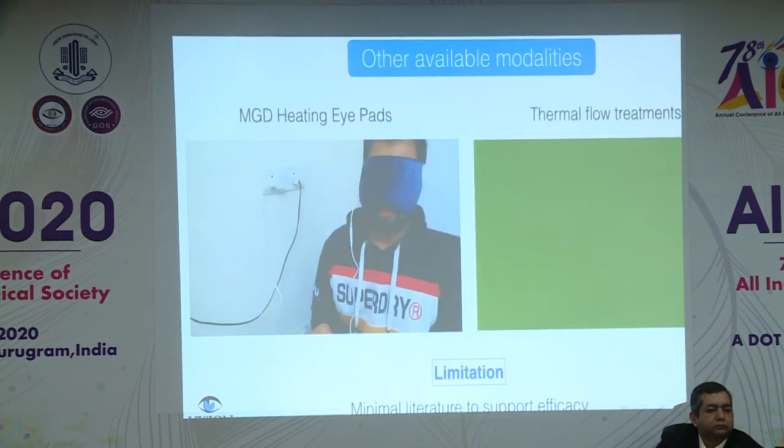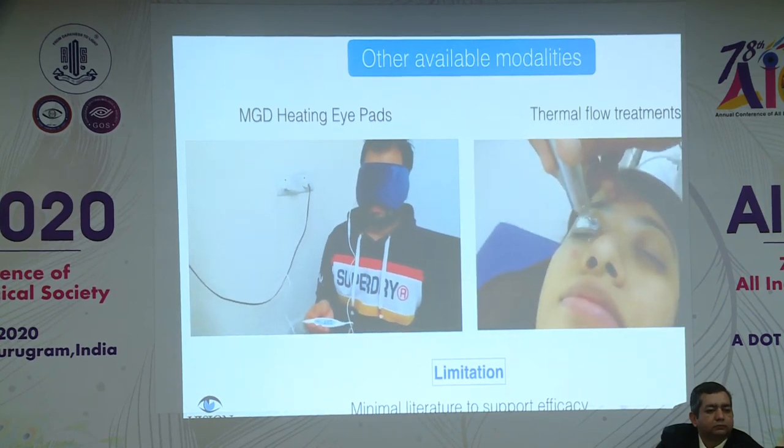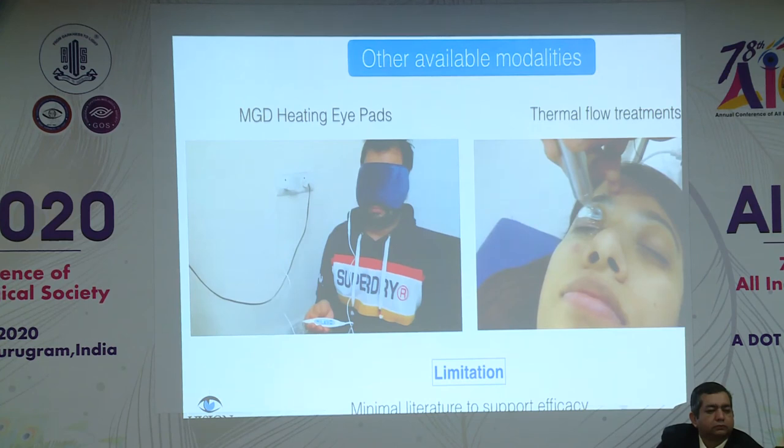There are other available modalities as well, such as these heating pads that are available. This is something called Meibo Thermoflow, and I've used them, and symptomatically, I do believe patients are better, but there is not much literature to tell you how effective they are and how long the treatment actually lasts.